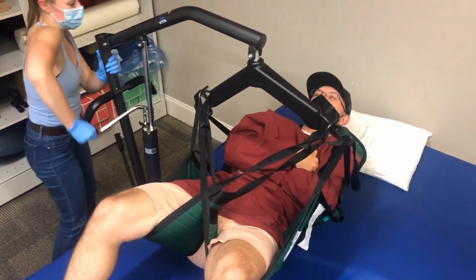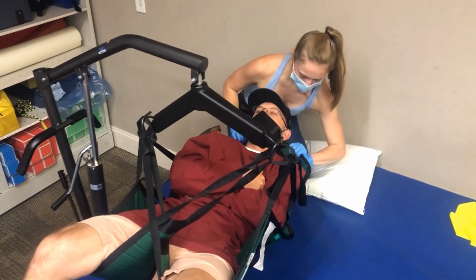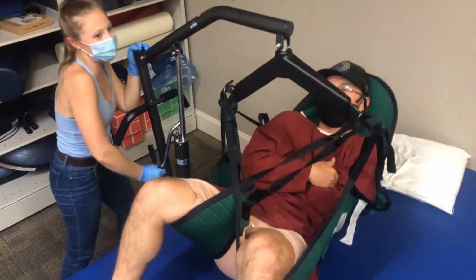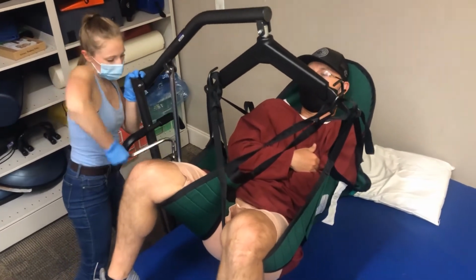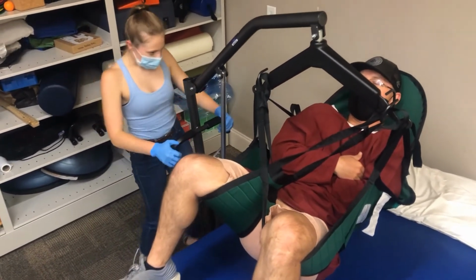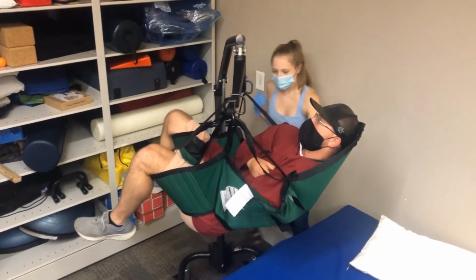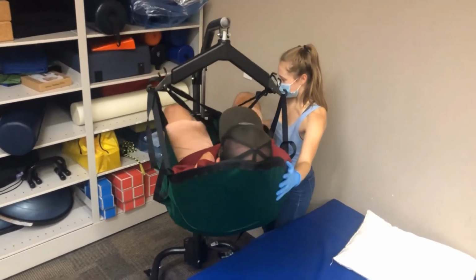Continue to raise them up until they are completely off the bed. Your loved one should sit comfortably in the sling as shown. Unlock the Hoyer brakes and move them to their desired location. You may swivel your loved one around as needed.